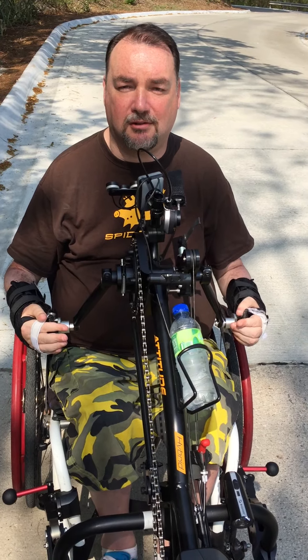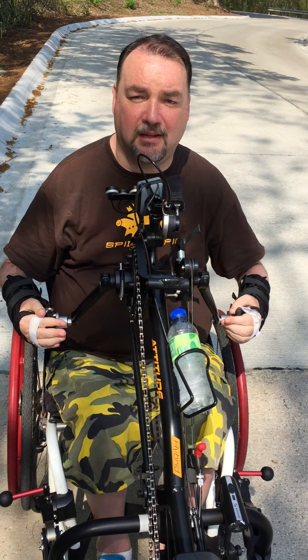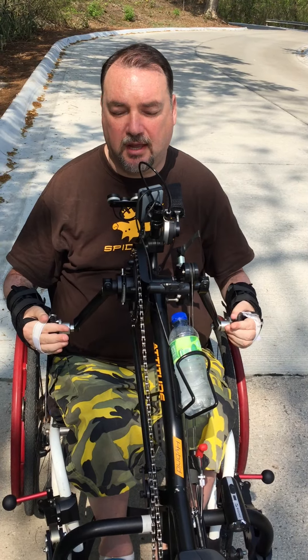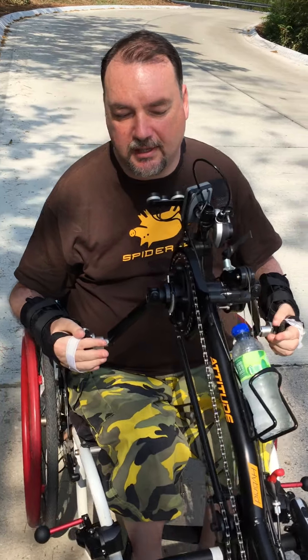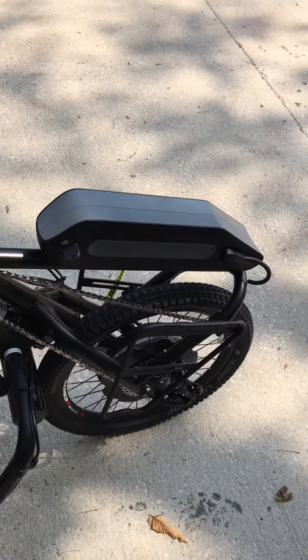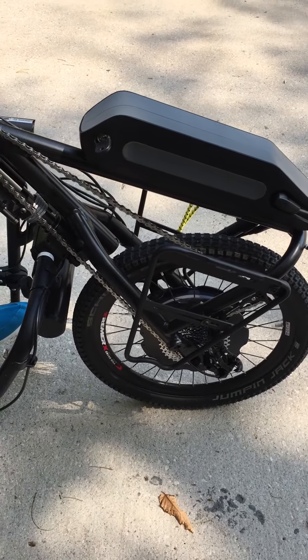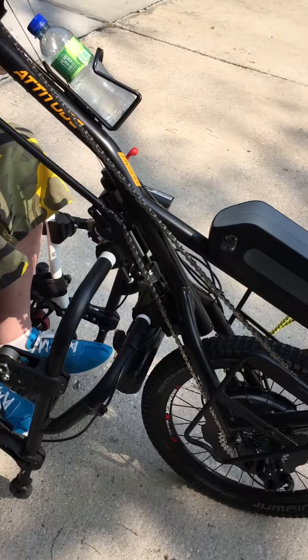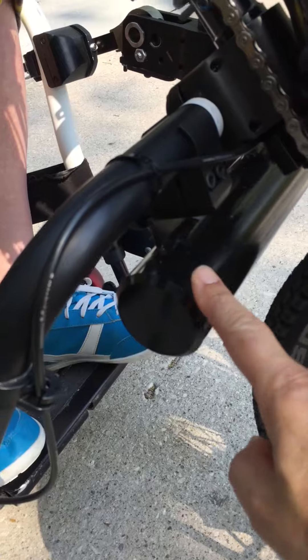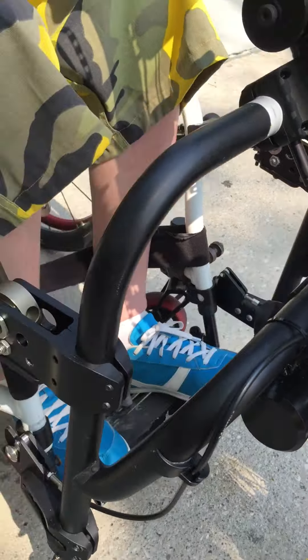This is the new Sunrise Medical Quickie Attitude handbike, specifically made for tetraplegics. Dead easy to use. If you come around here you can see the battery on the front, the power assist motor on the front wheel, the derailleur with all the gears. We've got extra weight on the front as well. The coupling to the bike shows you how it's joined to the chair.